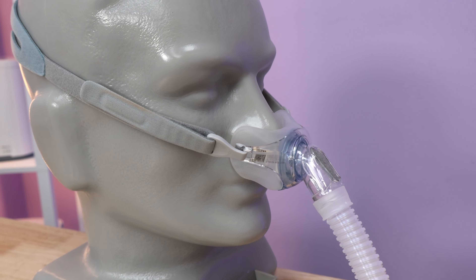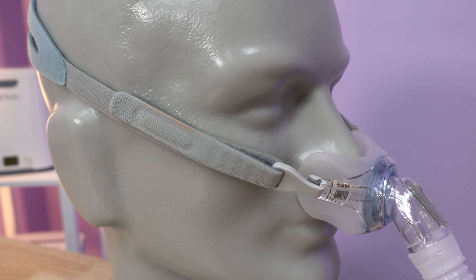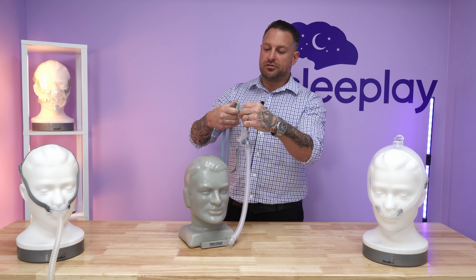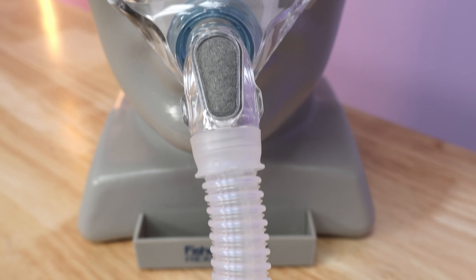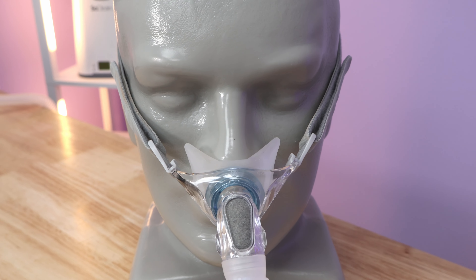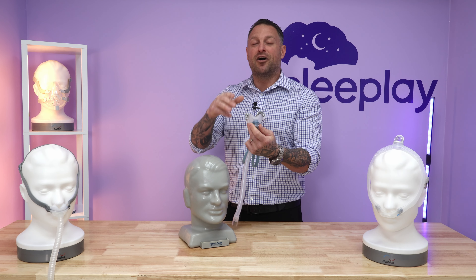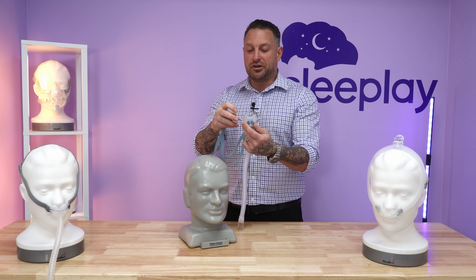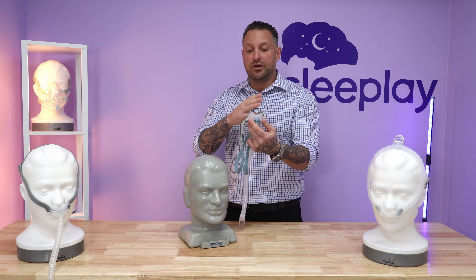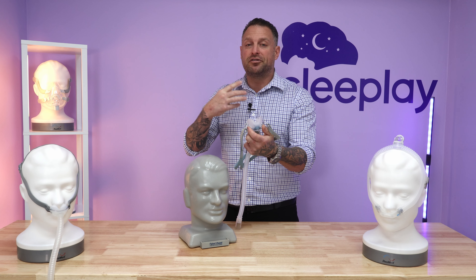This is how it's sized: it doesn't have a rubber stretching tool like the P10, but it has little Velcro straps. You pull off and basically just pull this tighter if you'd like to, then Velcro it back on. The pillows on this one — Fisher & Paykel came up with this U-shaped, wing-shaped design to help minimize any leakage. Unlike straight-across pillows some masks have, this one is shaped around the nose so there's not so much leakage.